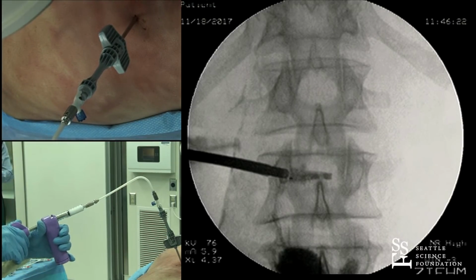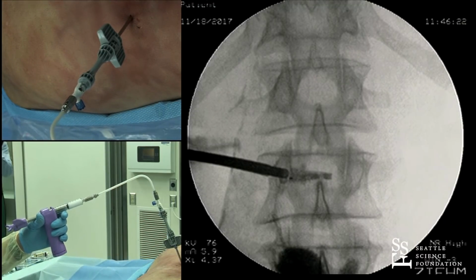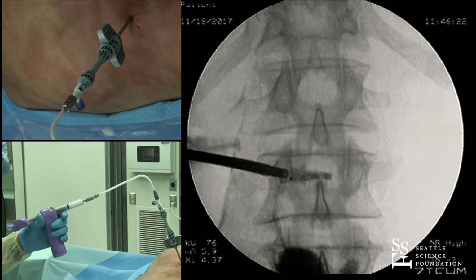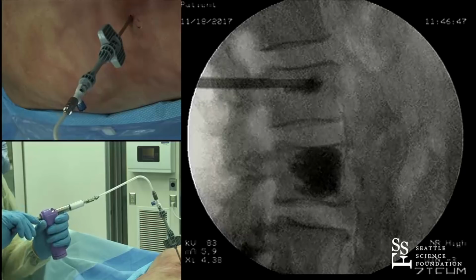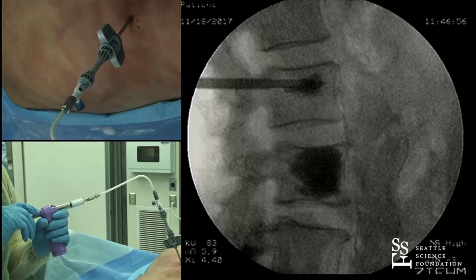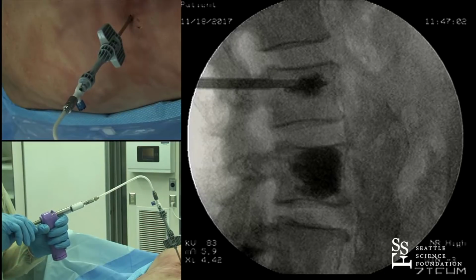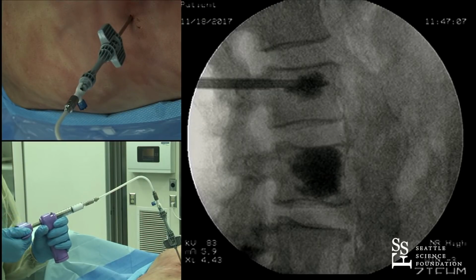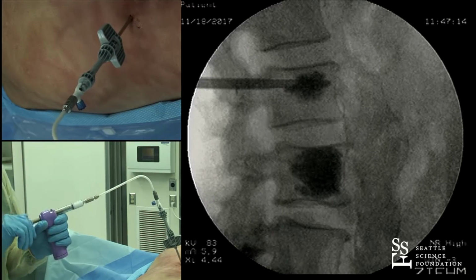The difference between this and some of the other techniques is the cement for this is very liquid. It's shiny whenever you first pass it through the needle and through the needle cement delivery device, and it's designed to have more of a liquid cement delivery than the much more thick, toothpaste-like delivery consistency of the previous case. So coil in place, cement going in. Turning is very easy because it is very liquid cement. And you can see it's kind of a tubular shape. It's designed to inject from outside to in.